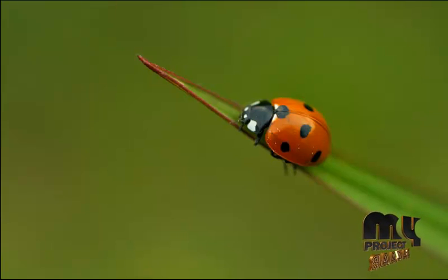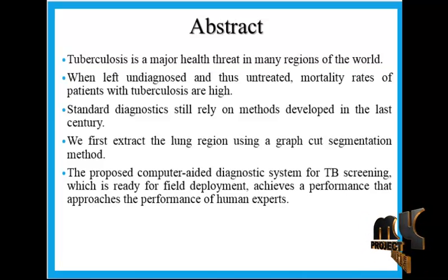Welcome to projectbazaar.com. Now let's see about automatic tuberculosis screening using chest radiographs. Now let's see about this abstract.